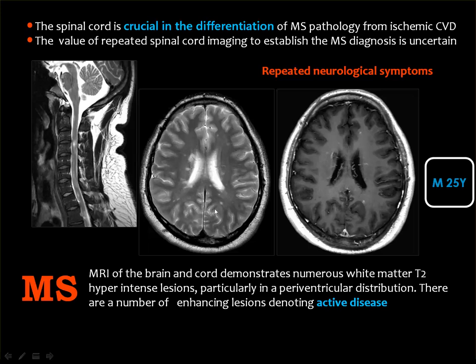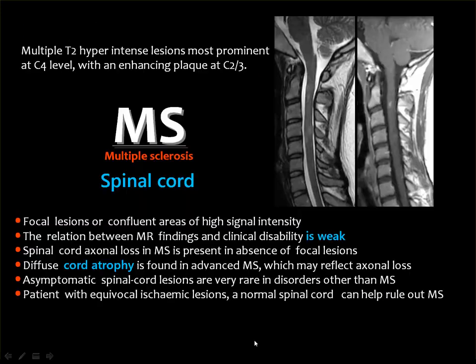This will help to confirm your diagnosis of these lesions to be related to MS. They said that other diseases which produce plaques in the white matter do not usually cause any changes in the cervical cord. And of course, the issue of contrast enhancement is the same for the brain and the same for the spinal cord.